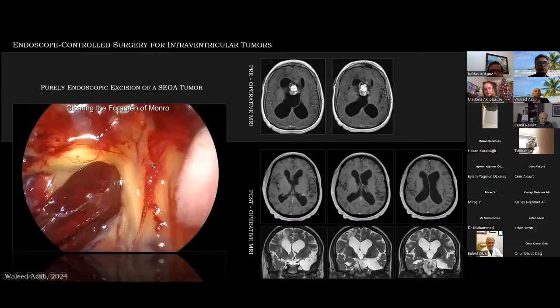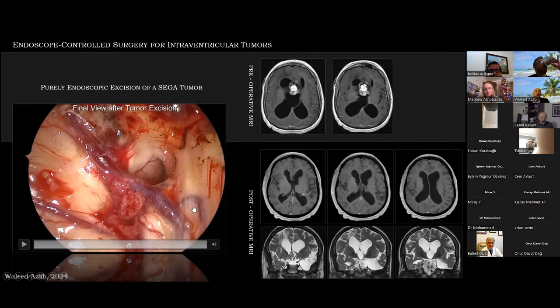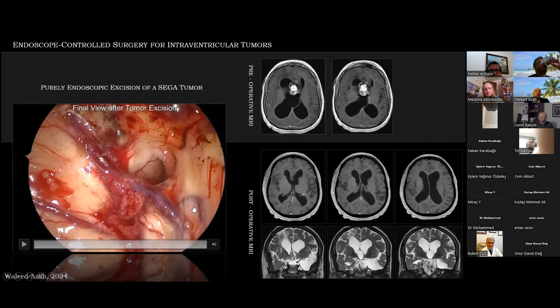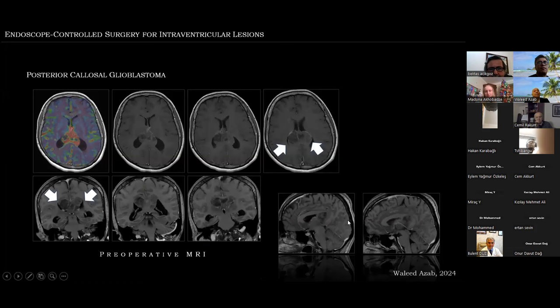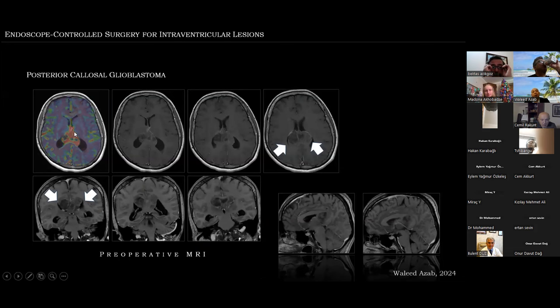Another case: a SEGA tumor in a 34-year-old patient. Snapshots from the procedure are shown — everything is cleared at the conclusion at the foramen of Monro. Pre-operative MRIs are in the upper panel and post-operative MRIs are below. Another further example for endoscope-controlled surgery of intraventricular lesions: a posterior callosal glioblastoma in a middle-aged lady — note the tumor was not much enhancing because of its very aggressive nature.